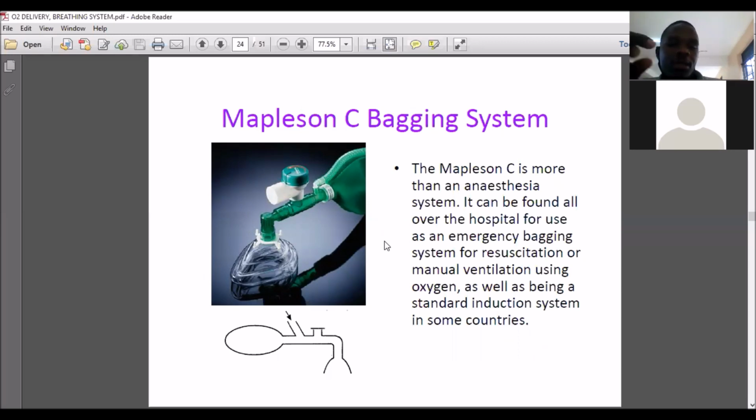Now, for this one, the valve can control both what you breathe out and what is coming in. It's one valve controlling both. In the other ones, the oxygen is not controlled by the valves. The valve just controls what goes out and what goes in the bag. But with this one, the air coming in can first be stored, and what you breathe out can also be stored.